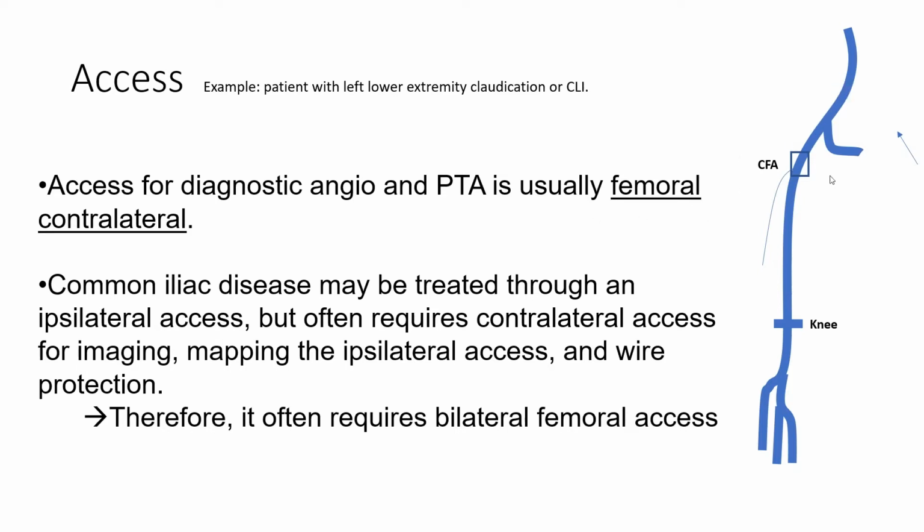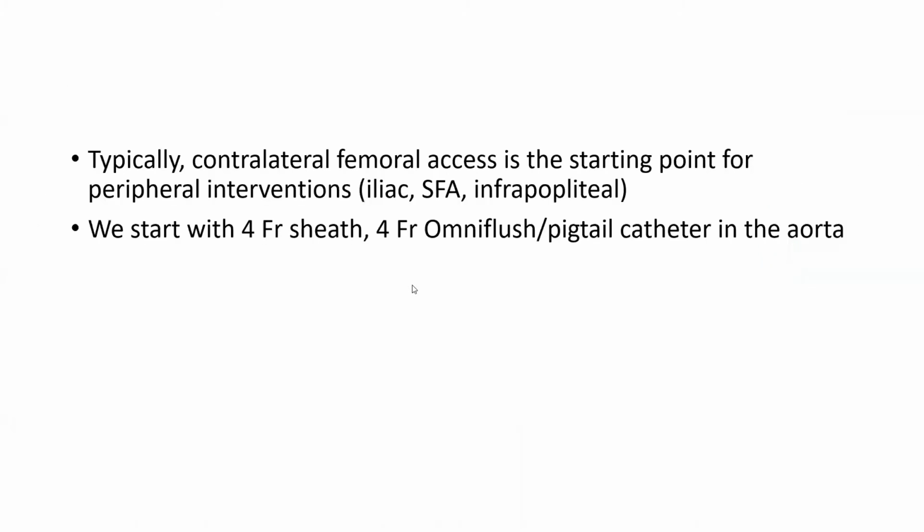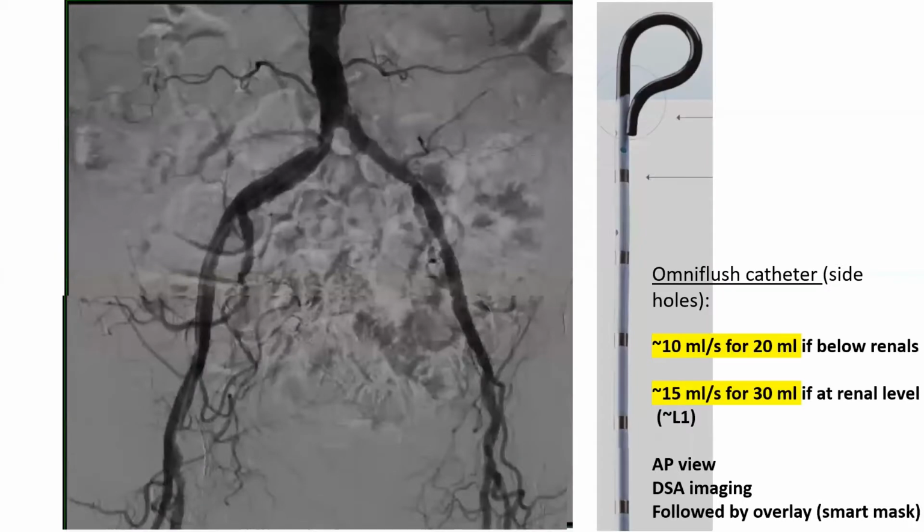Common iliac disease often requires bilateral femoral access. Even if you treat it ipsilaterally, you often need a contralateral access for imaging and guidance. So typically we start with a contralateral access.